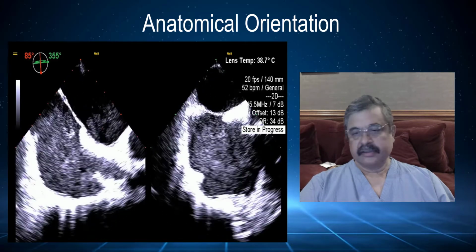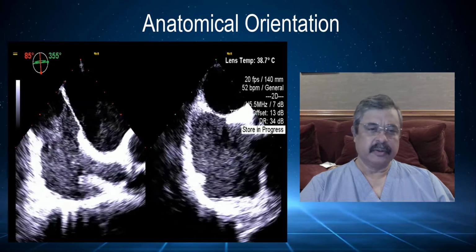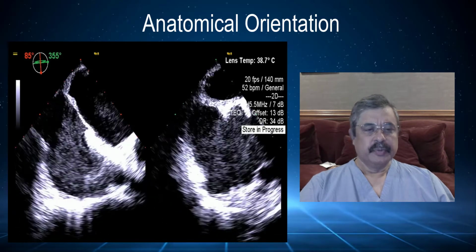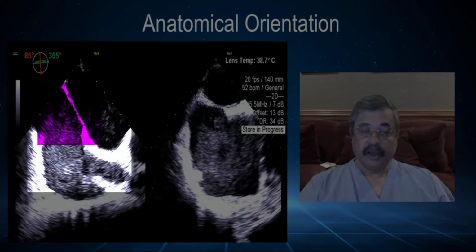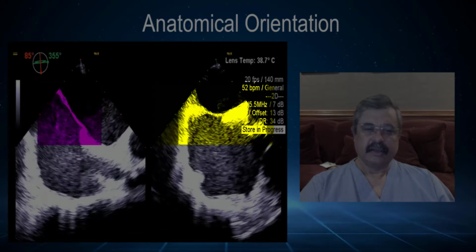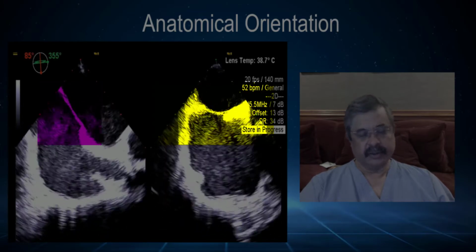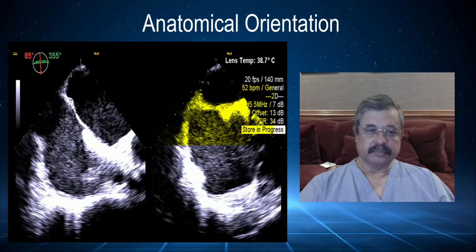As can be seen in the simultaneous orthogonal view of the interatrial septum to the heart at a slightly oblique orientation, the superior and inferior extents of the septum are rather long. However, the anteroposterior extent of the septum is very short, implying that the fossa ovalis is very elliptically shaped in this patient, which makes it a challenging anteroposterior septal puncture.